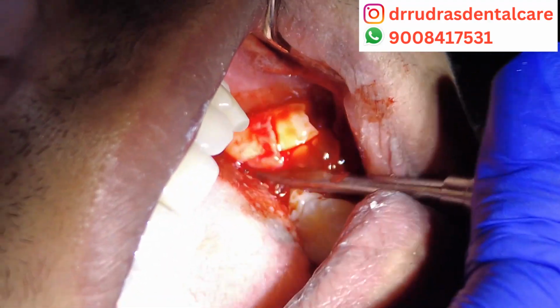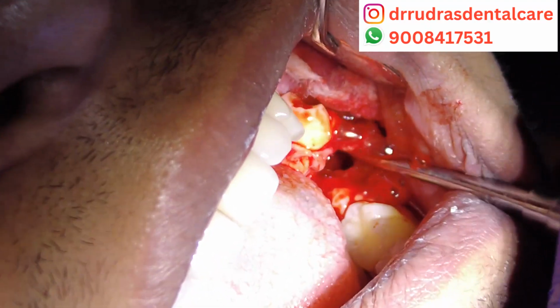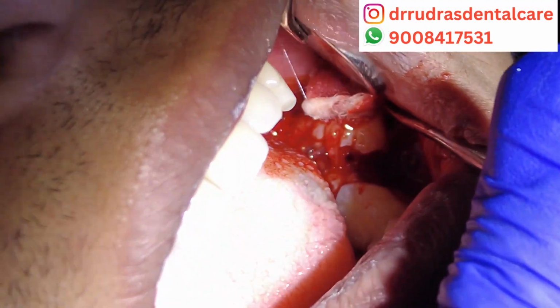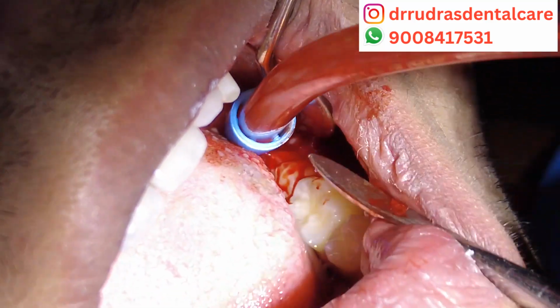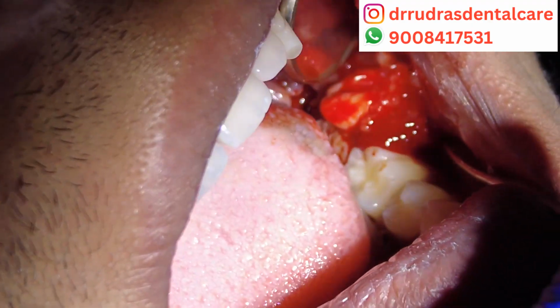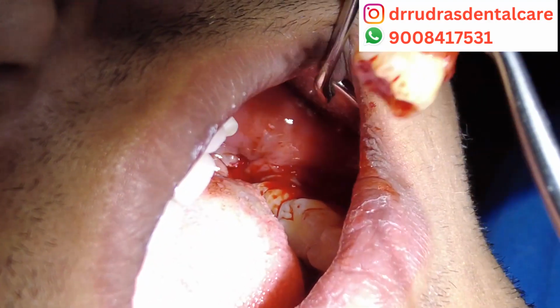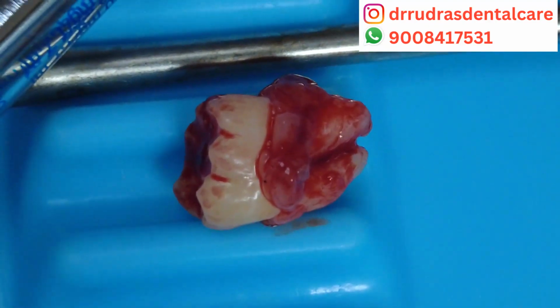And here you can see that we are trying to take the tooth out, and with the help of proper suctioning and all principles of oral surgery, we are managing to take the tooth out, and we have finally taken tooth number 3/8 out of its socket completely. As you can appreciate, this is the completely intact impacted tooth, that was tooth number 3/8.